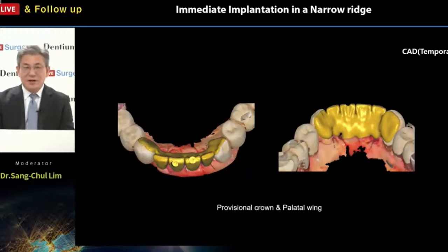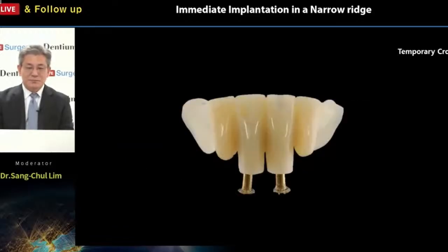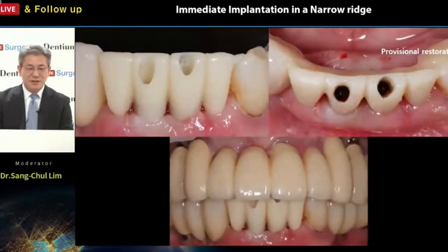Why? This temporary contacts the neighbor and strengthens the neighbor teeth with resin bonding, right? So this extremely reduces the stress on the just-inserted implant fixture, right? So this wing is important, and a clever procedure. Okay, and the hole on the labial side doesn't matter because of the temporary. Insert it into the patient's mouth with the wing. This wing contacts the neighbor teeth with resin bonding.